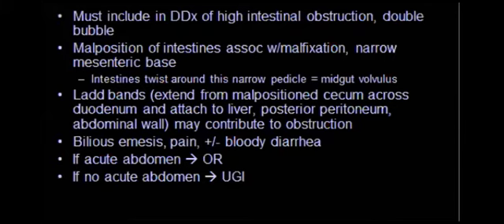Okay. And the main clinical presentation: this patient will come with bilious vomiting or non-bilious vomiting? Do you expect, with this patient, this is an MCQ, he will come to you. The obstruction is distal to the ampulla of Vater, so it is bilious vomiting. Perfect. So you expect that you will see that in the MCQ, it will be bilious. So this will be bilious vomiting and a surgical emergency.